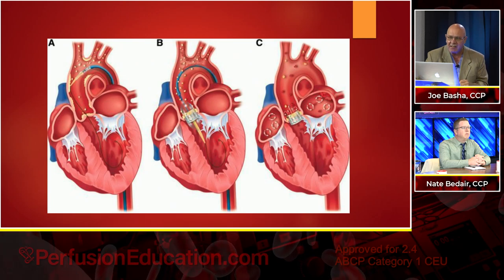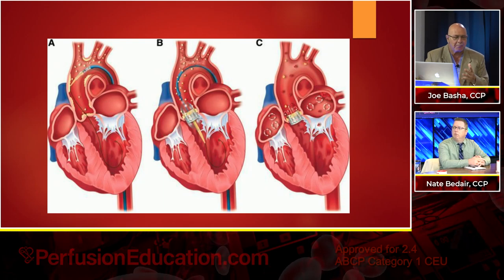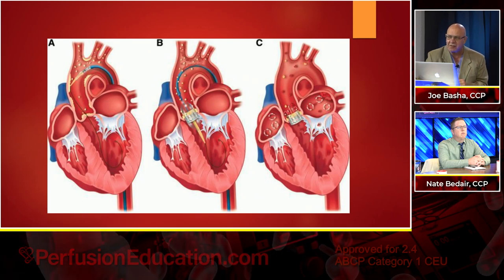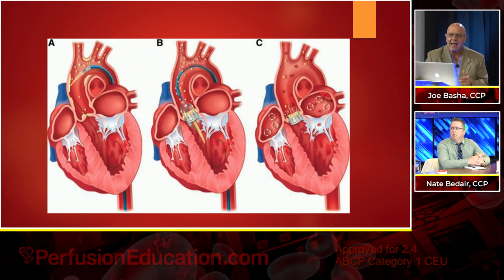Then it goes in, and as you're passing it through and dilating the valve to implant it, you have another massive shower. And then as you take it out and it just sits there for a little while, it's still going to be some residual showering that takes place. What effect did that have?